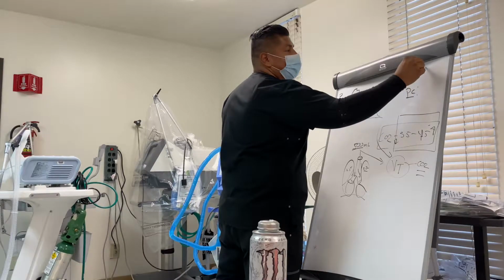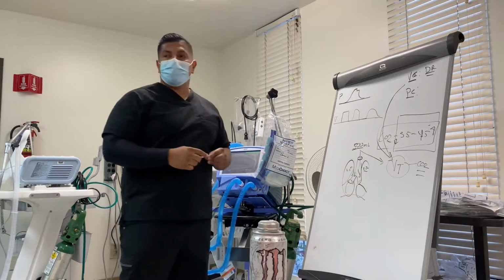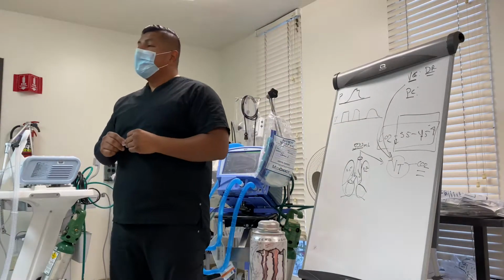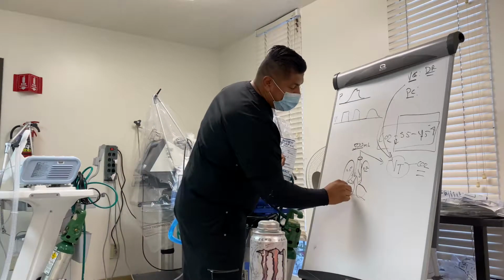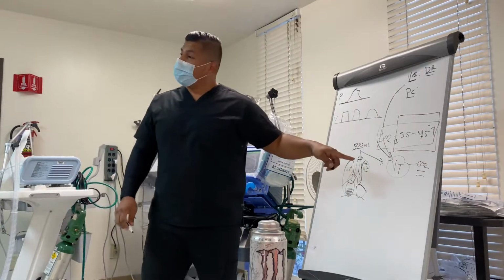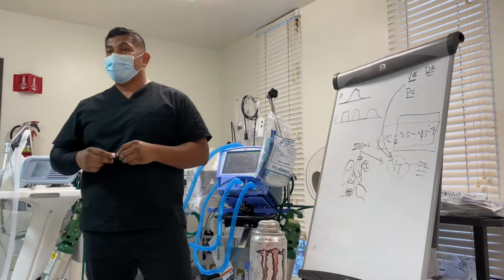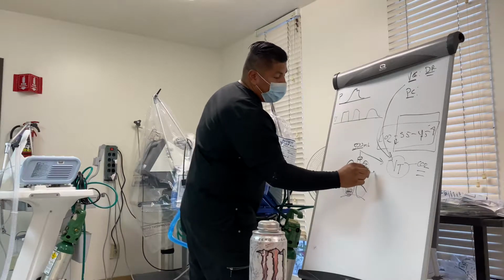Well, we've established this is the doctor's favorite because they have total control of the CO2. But the way that the vent delivers this tidal volume, it doesn't care. It does not care at all. Because a lot of these patients will have atelectasis on one side, maybe a slight pneumo. Now, is it 250, 250? No. Maybe it's 150, 350. Now you're hyperinflating a good lung. Correct? So pressures are going to change on one side greater than the other.